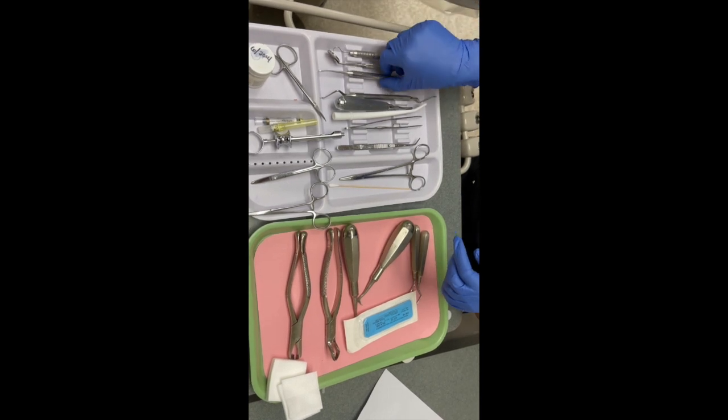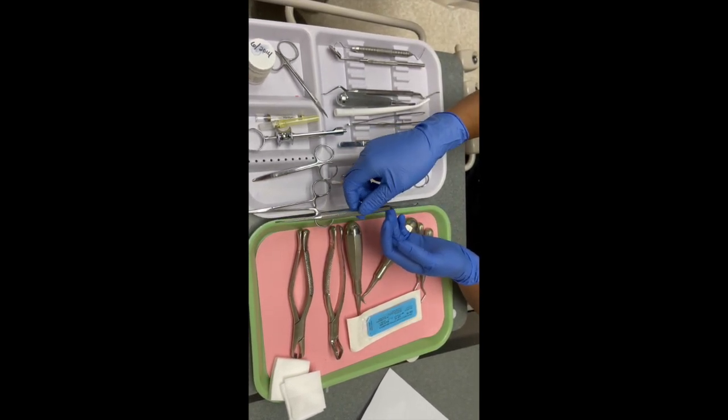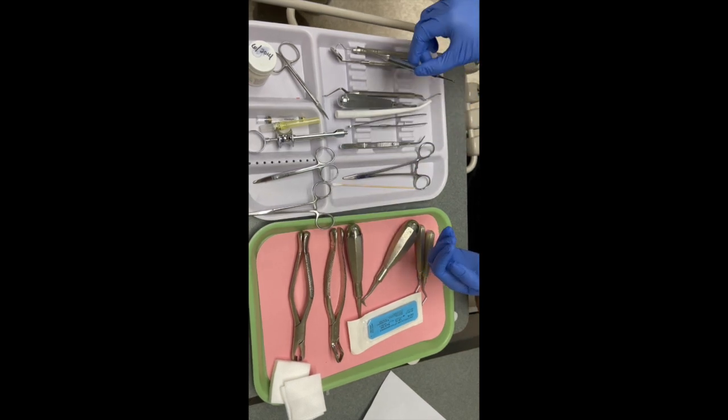Next you have your straight elevator to loosen teeth, or separate and lift the tooth from the socket.